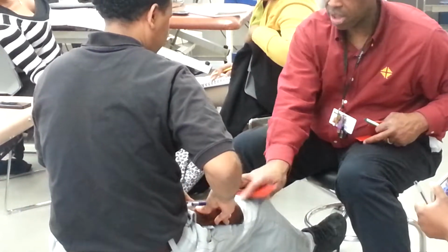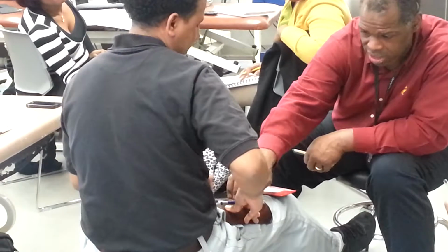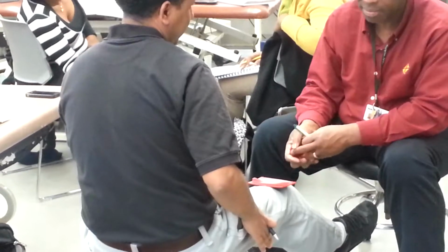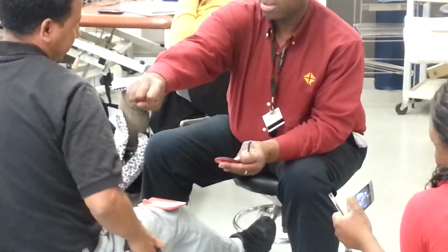Give me 2 square ones over there, on the opposite. 2 big square. Bigger than that. Yeah, 2. All right, so what's going to happen now? It still isn't going to work. Because the energy goes to that one, and it comes to this one, but you don't feel it in between, and you don't feel it underneath. Where you feel it is here, here, and in between. So that's when movement is going to happen. If movement does not happen in between, then I can't contract the muscle.